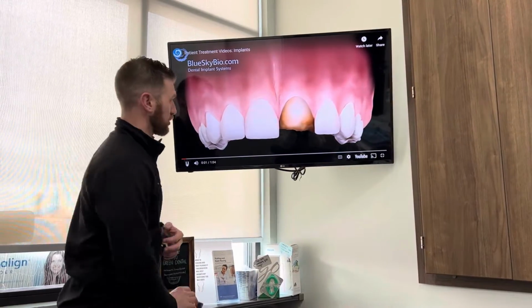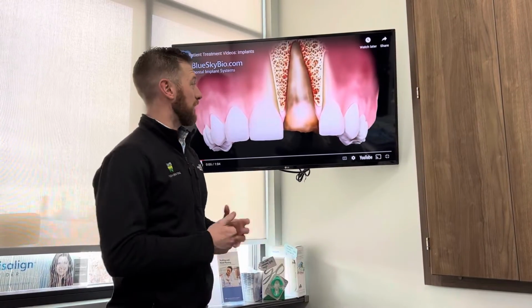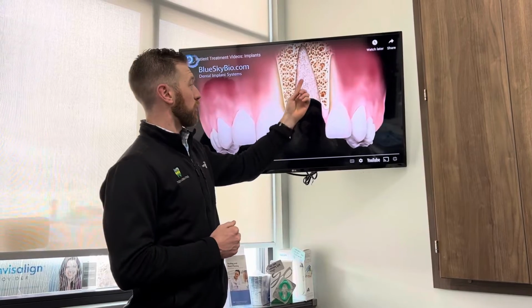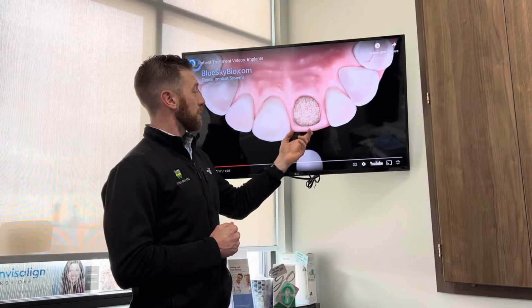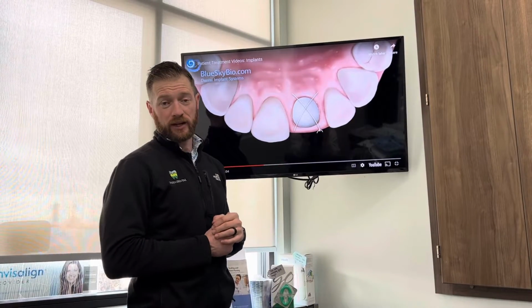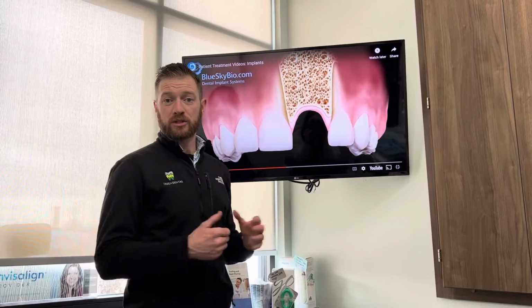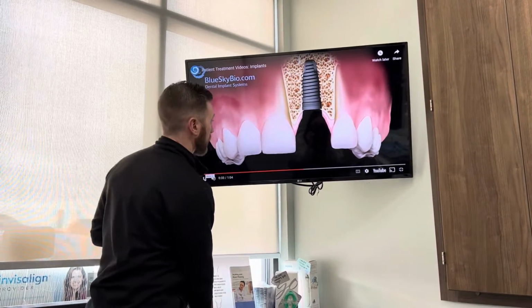So this example shows a front tooth where the patient's tooth has an infection and it needs to come out. So first things first is take the tooth out, clean the bone so that the bone is free of infection, and put a bone graft in, okay? We may or may not cover it with a small membrane, which they show here, and we throw a couple stitches in, okay? At this point, we're gonna let the area heal for about 12 weeks. So during that time, we're just letting it heal, letting your bone remodel and get strong again, okay?